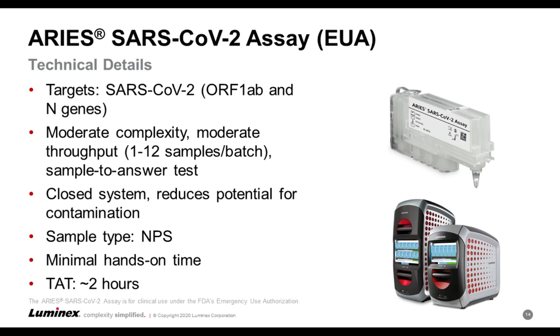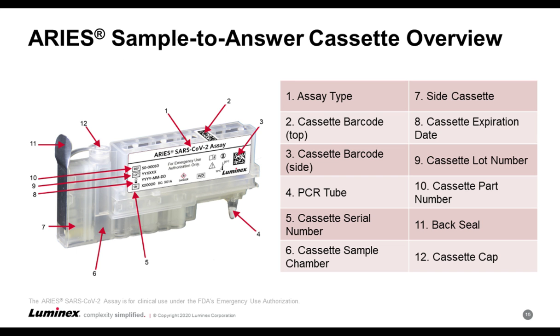It is a closed system, which reduces the potential for contamination. Its preferred sample type is also nasopharyngeal swabs. It has minimal hands-on time, and the total turnaround time is approximately 2 hours.